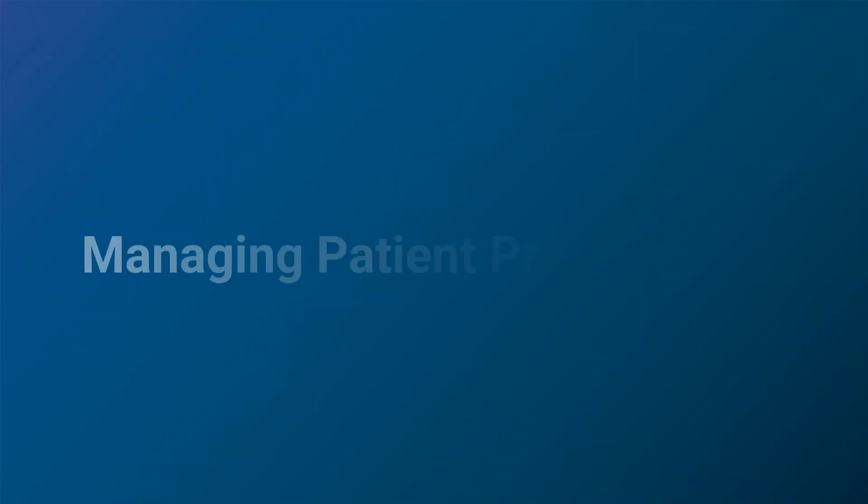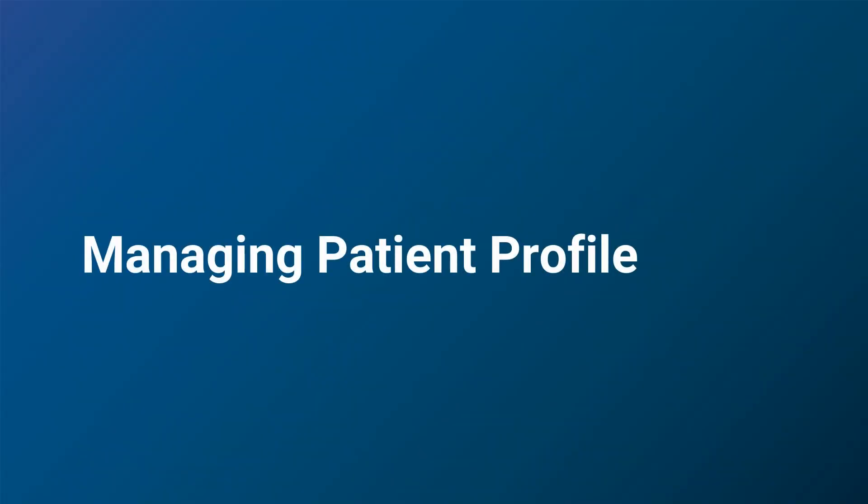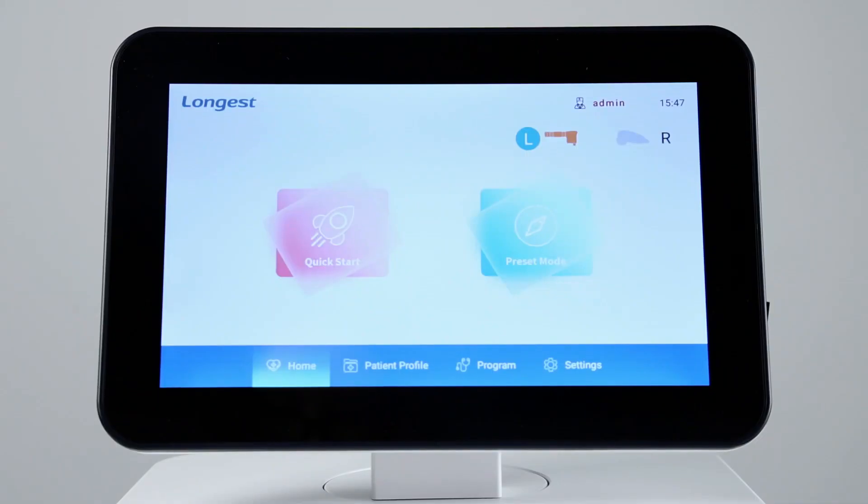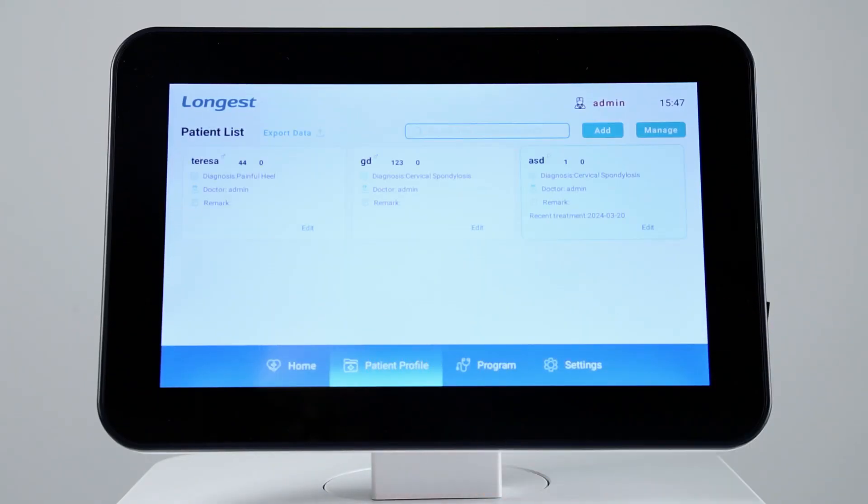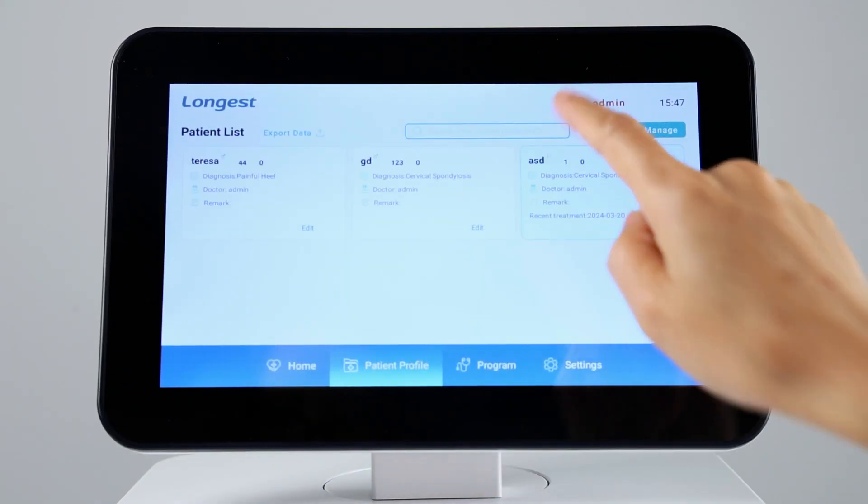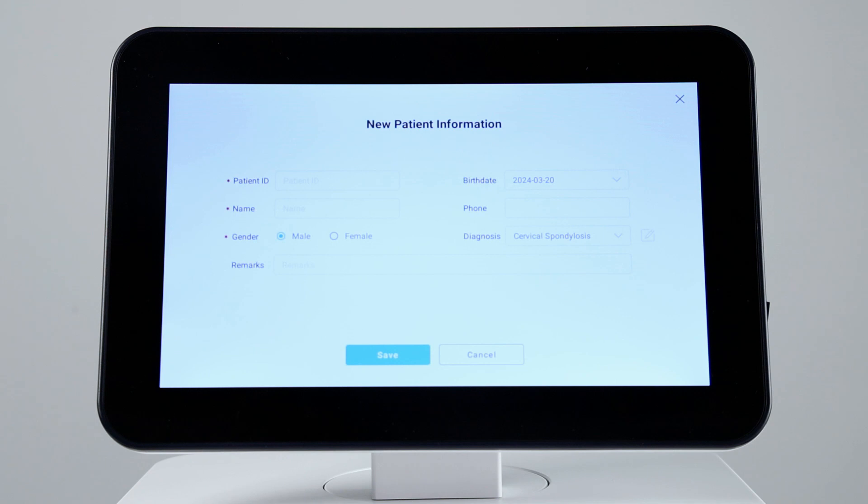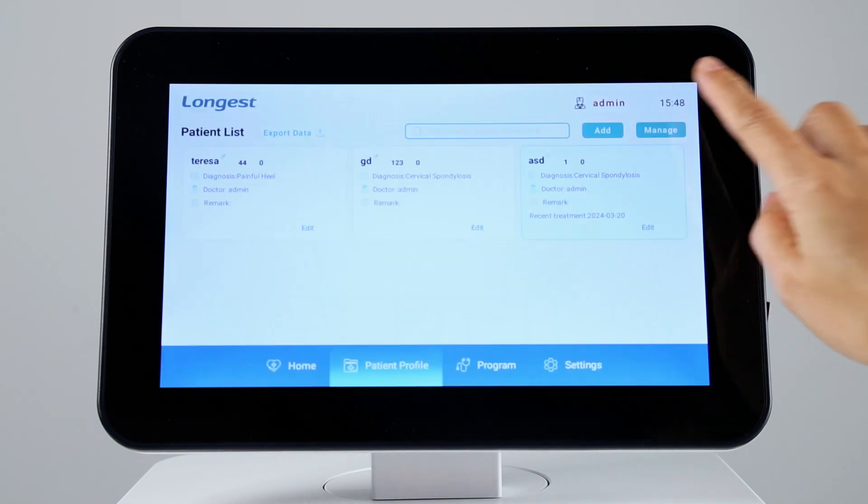The device is integrated with a patient database to maintain detail records of patient information. Click patient profile, in which you can view, add, and delete patient information.